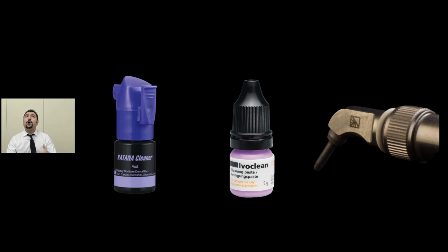Why is IvoClean helpful? All right, so we remember that the zirconia surface had zirconium oxide, and the phosphate group of MDP was going to bond to that surface through the zirconium oxide. Now, in saliva, we also have phosphate groups, and the phosphate groups in saliva are going to block those zirconium oxide surfaces that were going to be bonded with MDP, for example. That's why we have solutions like IvoClean.